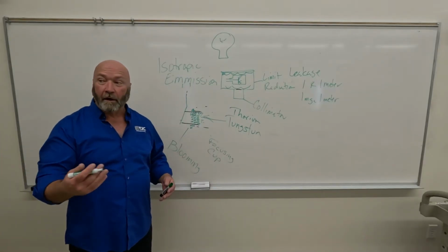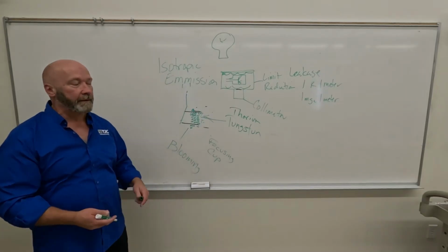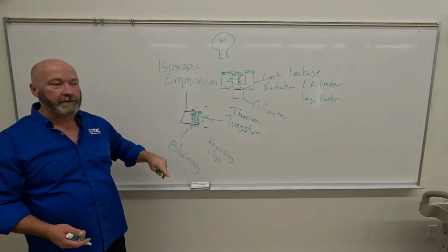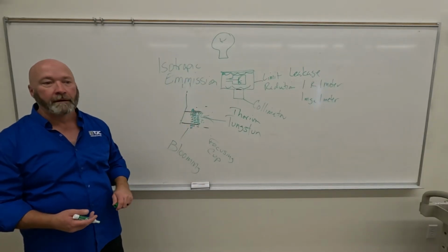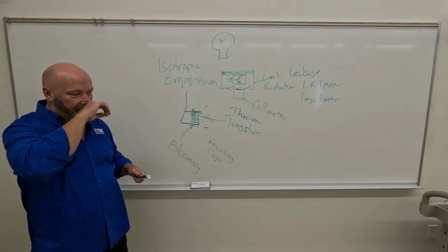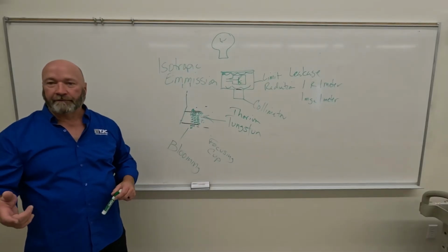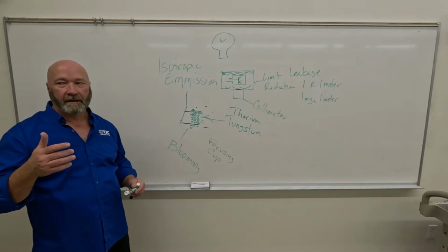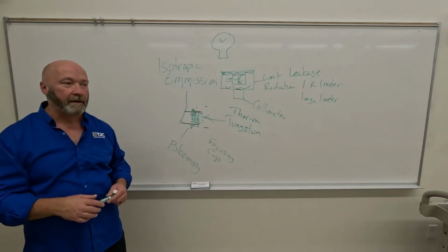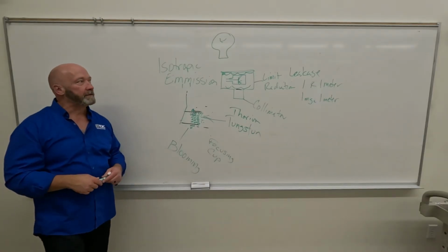Why is it a reason for tube failure? Because the main cause of x-ray tube failure is heat, right? So we burn out a filament. If we can burn out a filament here, we can burn out a filament here. That's what we refer to as open filament. Your tube doesn't shoot anymore. You can diagnose open filament this way: if you set a technique that would work on large and small filament, and it'll work on one but won't work on the other, you got a filament that's burnt out. So, it doesn't completely kill the tube, but it does kill one of the filaments.